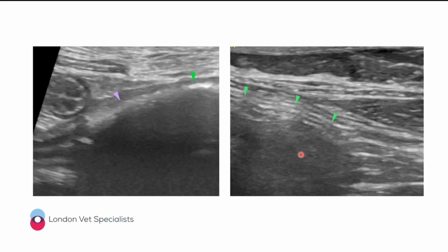And even though there is some shadowing here, it's very dirty shadowing. And it's dirty because of all the reverberation artifact that we're seeing here. So this is gas in the colon. This is not a small intestinal foreign body. This is colonic wall. This is reverberation artifact. This is gas in the colon. This is small bowel. This is strong, uniform shadowing. This is a small intestinal foreign body.